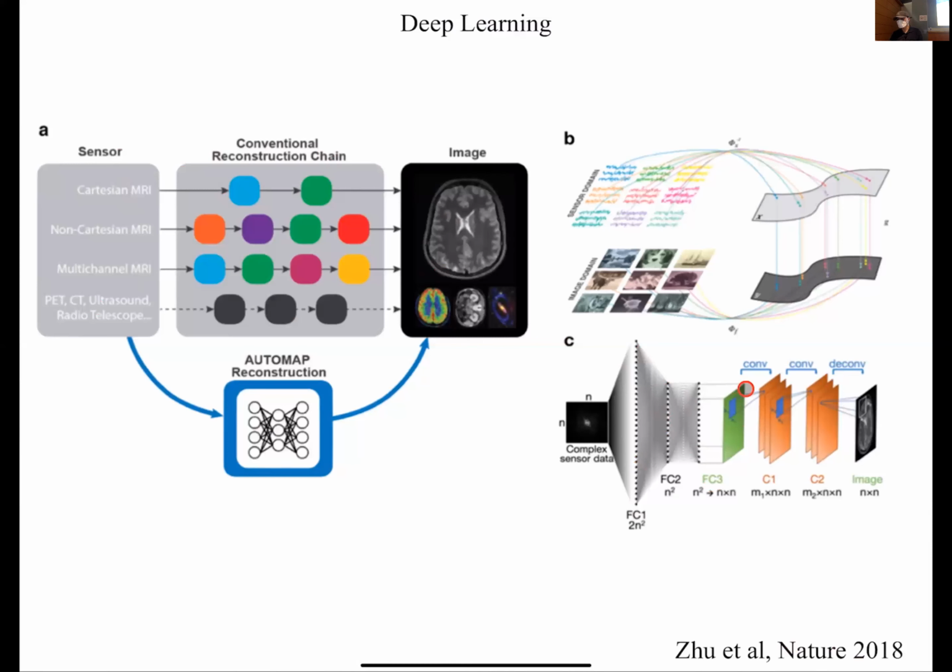And the idea is that it's going to take my data, right? Here's my data, and what I want to reconstruct are biological looking images, right? So those images lie in what's called low dimensional manifolds. Like if all the space is here, the solution space I care about is just some subset of that. So I'm going to look for those solutions that lie on that low dimensional subset. And the way I'm going to define that low dimensional manifold is by training on a lot of data. Right, I'm going to train it on something like the ImageNet data.